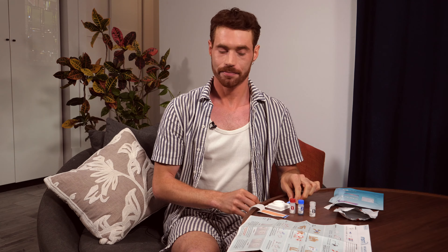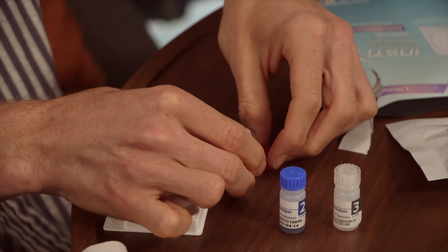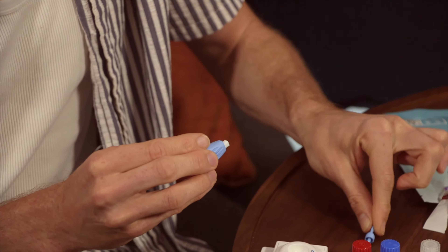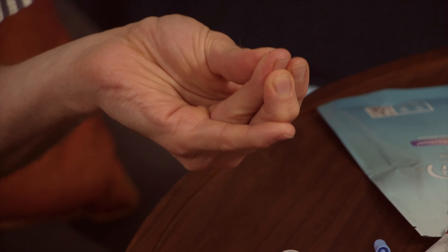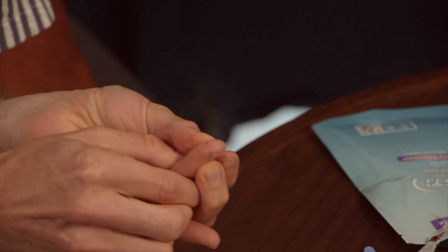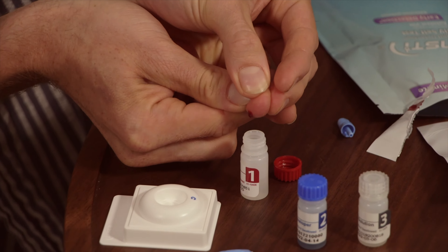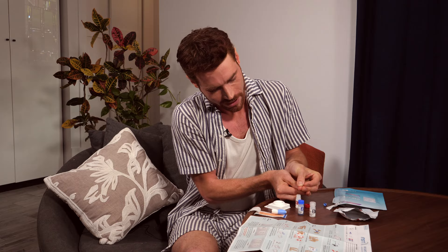And it's ready. Open the bottle, get it ready for your blood. Here we go, time to do the finger prick. Take this off first. Make sure you get a good fleshy chunk — the side of the finger is optimal — and just press. Then milk it from the base until you get a good little droplet. There we go. Now it's time to put on your band-aid.